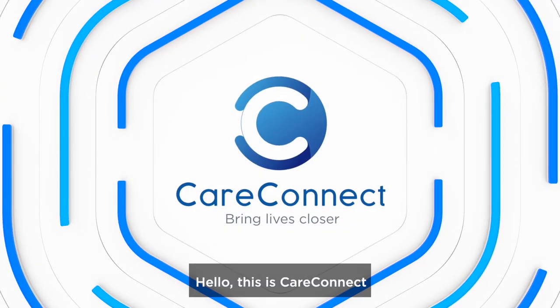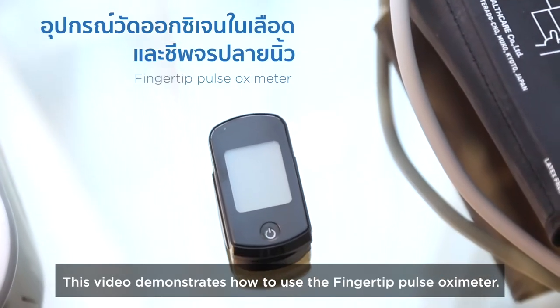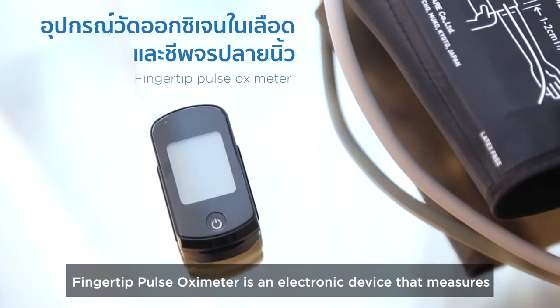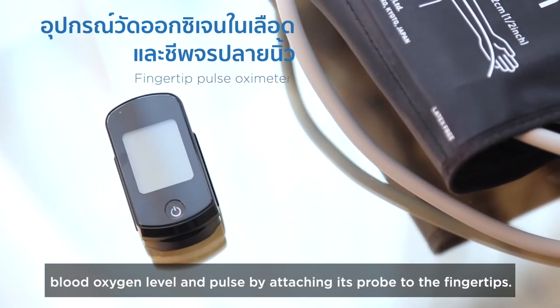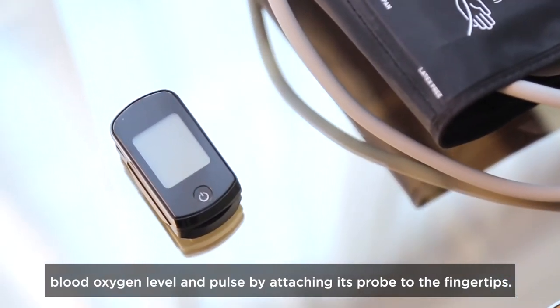Hello, this is CareConnect. This video demonstrates how to use the fingertip pulse oximeter. The fingertip pulse oximeter is an electronic device that measures blood oxygen level and pulse by attaching its probe to the fingertips.